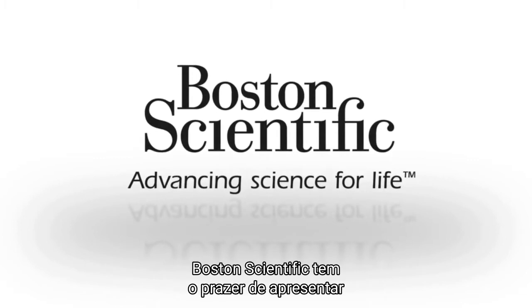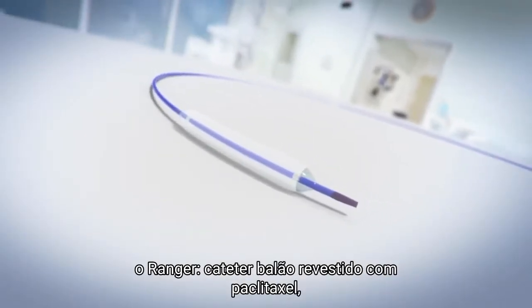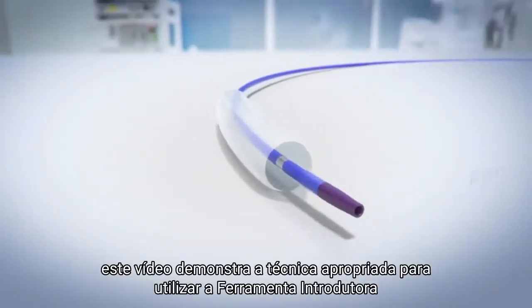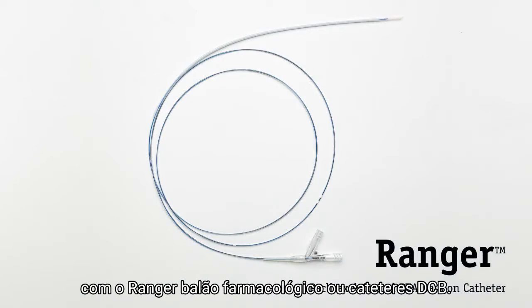Boston Scientific is pleased to introduce the Ranger Paclitaxel Coated Balloon Catheter. This video demonstrates the proper technique for using the loading tool with the Ranger Drug Coated Balloon, or DCB, catheters.